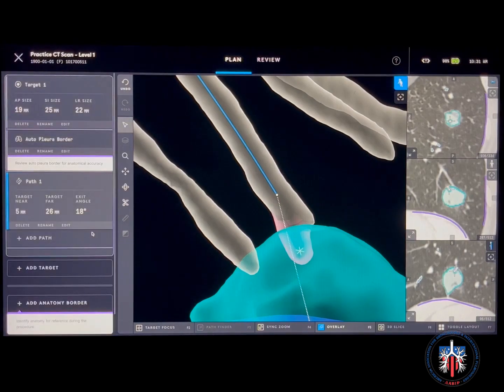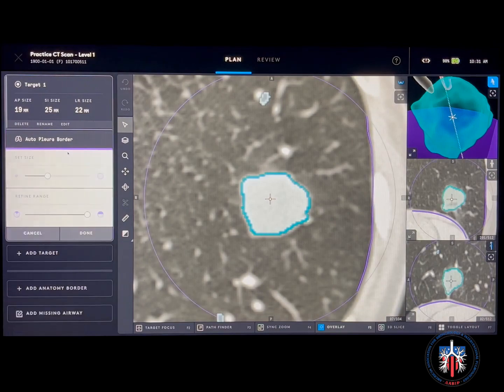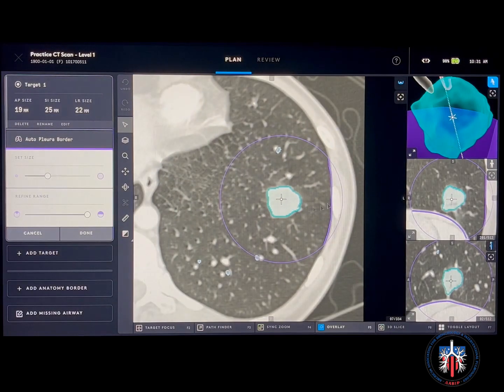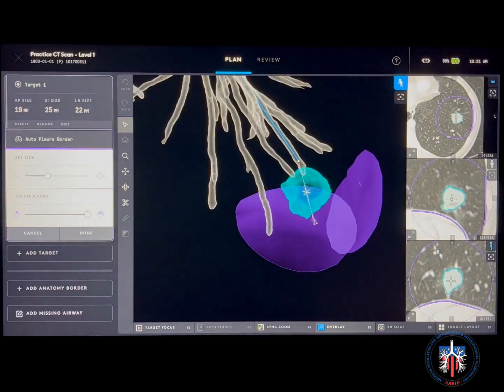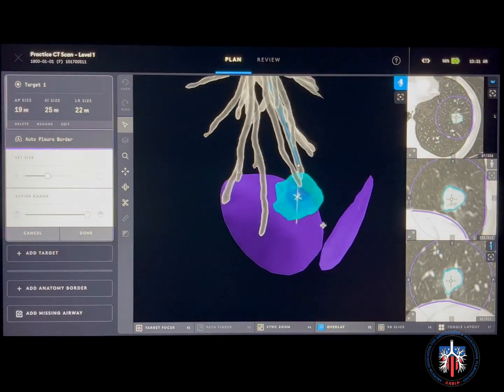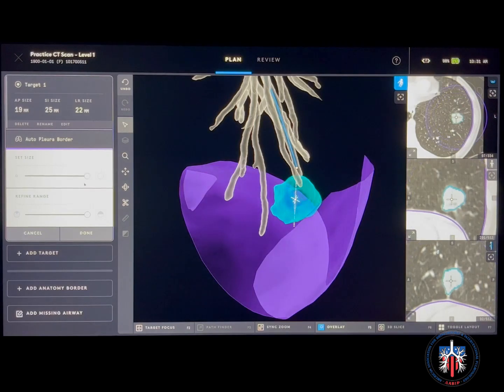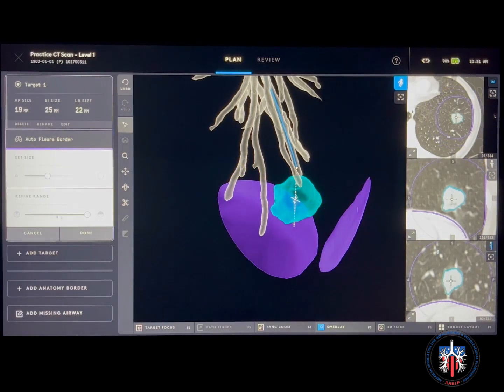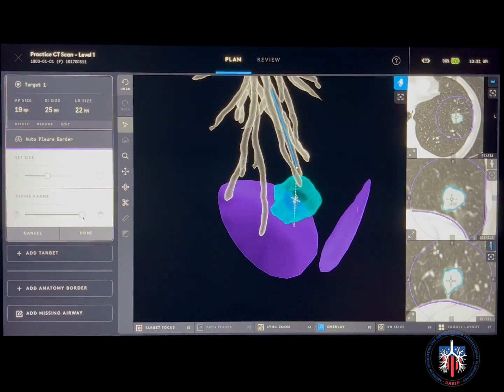Next, review the auto pleura borders highlighted in purple color. You can adjust the size and range of the pleura borders by using the corresponding sliders. You also have the option of creating your own anatomy borders.